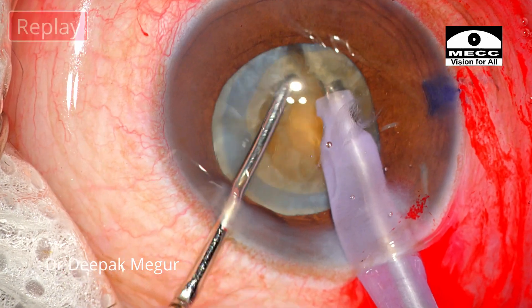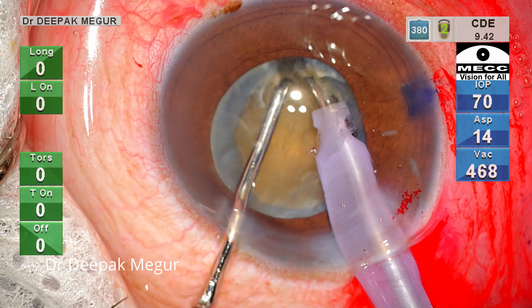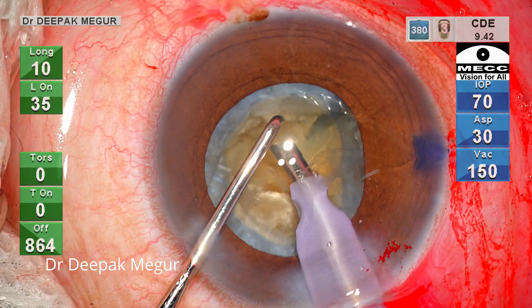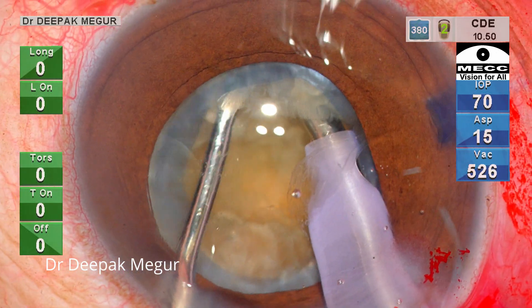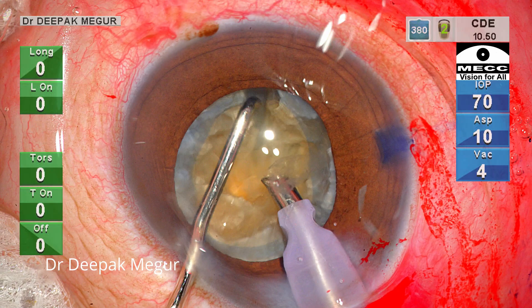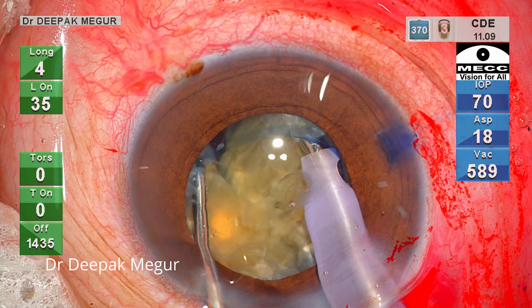As I'm laterally separating, the chopper is coming and touching the rhexis margin — I'm noting that here. So let's see how I modify my technique. The chopper goes down and I'm trying to be as gentle as possible, placing it at progressively deeper planes to separate those leathery fibers. In the initial 2-3 chops, the posterior plate is still not cracked — that's fine. The important point is that the chopper is being placed at progressively deeper planes, going down rather than pulling laterally. The key maneuver is to keep placing the chopper vertically down into a more posterior plane rather than using excessive force to laterally separate. If the chopper is placed more posteriorly, you don't have to exert a lot of force to break the posterior plate.